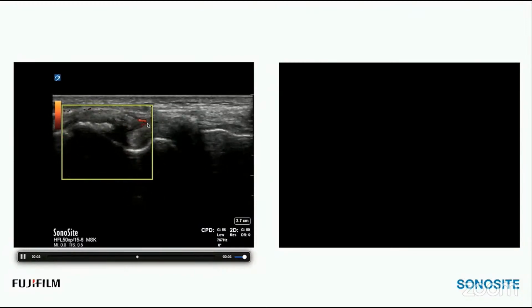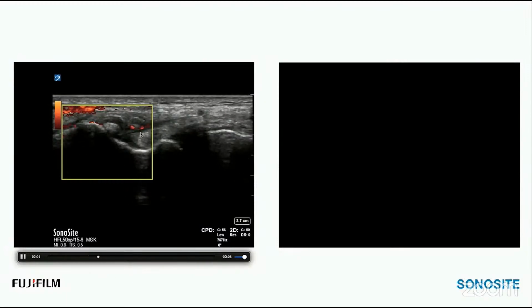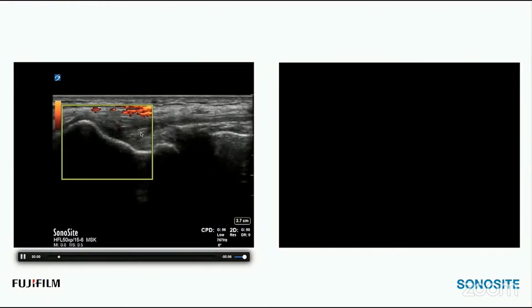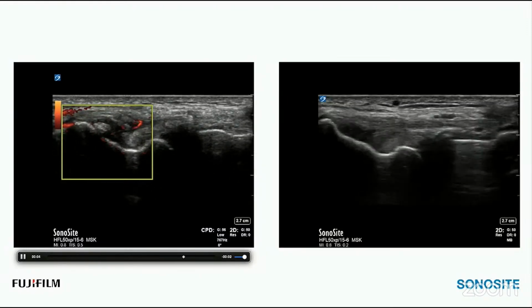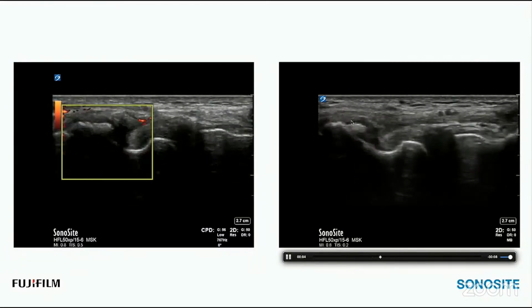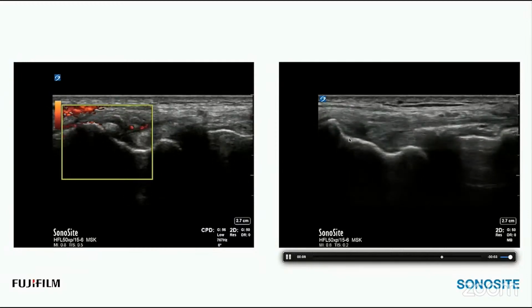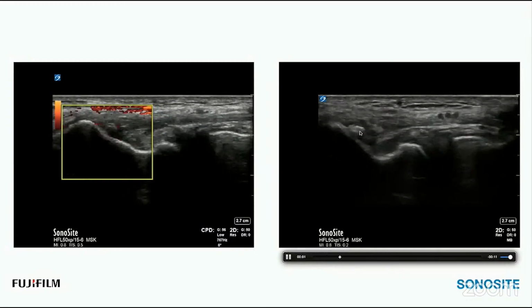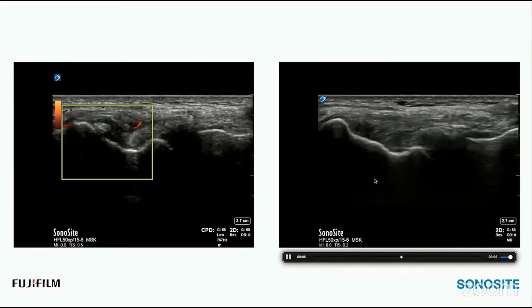But you can see this internal vascularity within the architecture of the ligament that should not be there. And that's why we traditionally set our ultrasound machines to detect low-level flow in the form of vascularity in areas that shouldn't be there. And then just panning through that in grayscale, just looking and appreciating this huge rock formation that's in the ligament. Shouldn't be there. At this point where you see it shadowing, that would show up on a radiograph, for example.